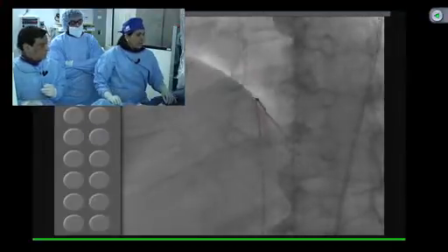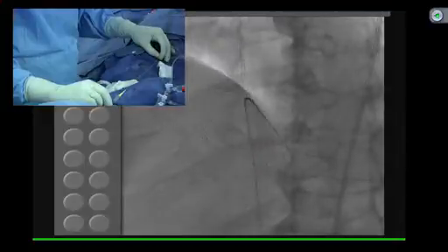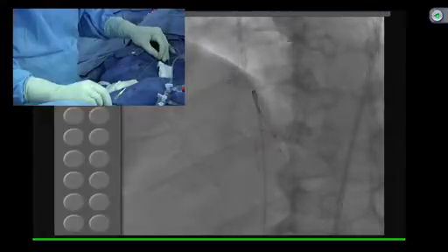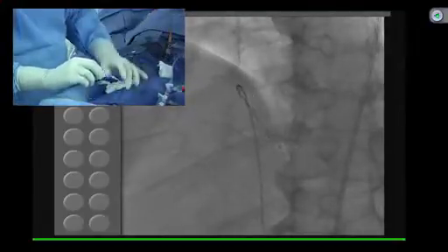If not, you come back and keep wiring till you know the movement of the wire, and now that the fine cross, in the meantime, you answer a question which has come by.